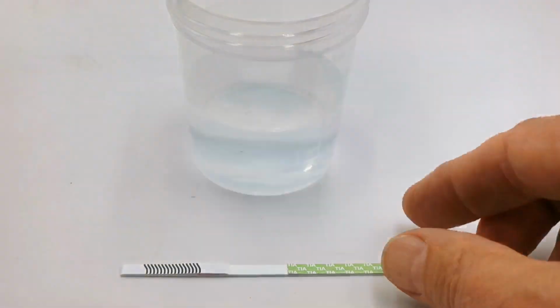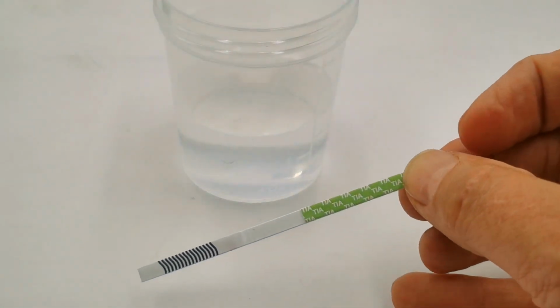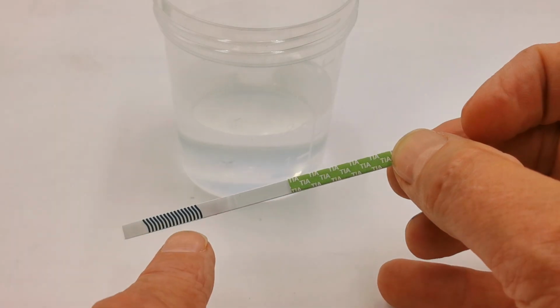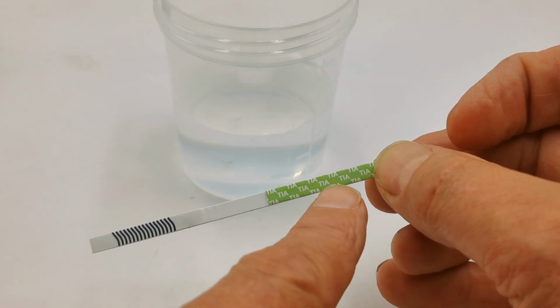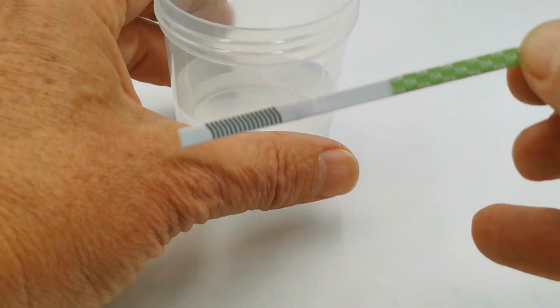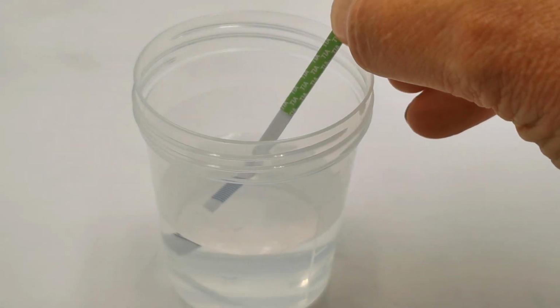and then you dip it into a sample of fresh urine. Now, this is a synthetic liquid we're using to demonstrate the test strip. The dip end is the end with the wavy lines. The maximum dip level should be the top of the wavy lines, and the handle end has the TIA, Tianeptine, coding on it.